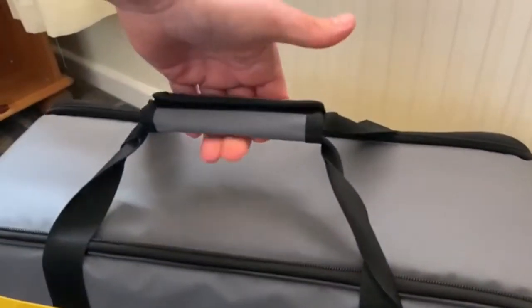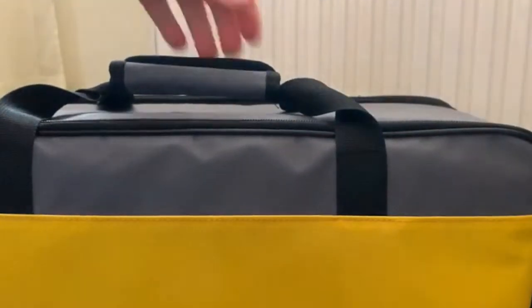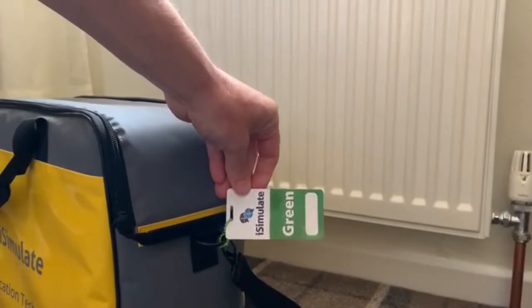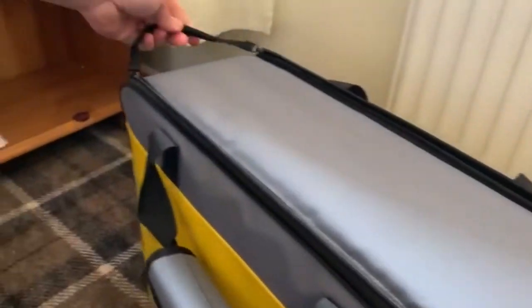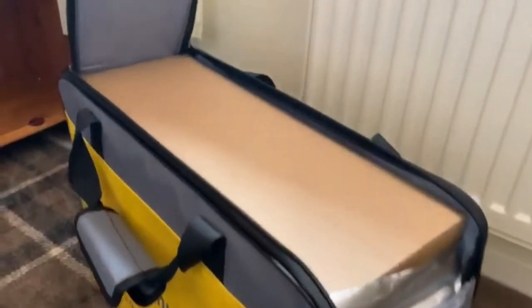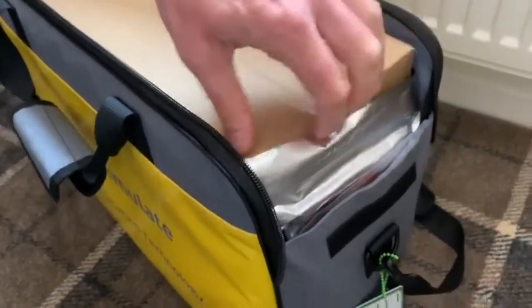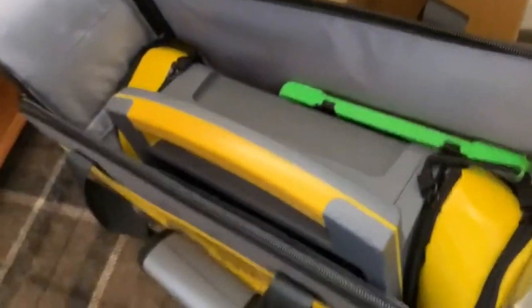We've got a shoulder strap like the old kit and we've got a hand strap. That will unzip and drop down. We have the tag and the hand grip at this end, and that zips back and allows us to unpack. Then we have a box which feels like it contains something but actually doesn't — there is our kit.